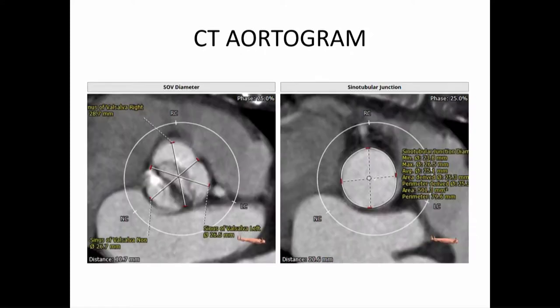It's again a bicuspid, which is the vast majority of cases that we see here. It's left-right fusion, a type 1 bicuspid. There's a fair amount of calcium on the non-coronary cusp. As you see in bicuspids, often the calcification is asymmetric. Here again, it's mostly on the non-coronary. The raphe is not that calcified, but has scattered calcium. But you see again, the leaflets are very thickened.